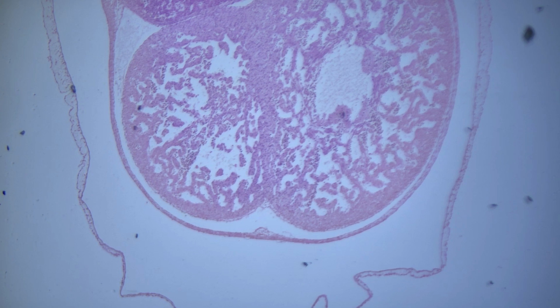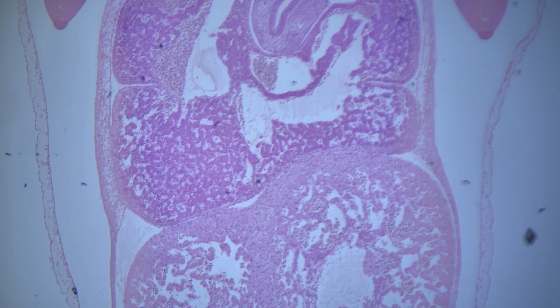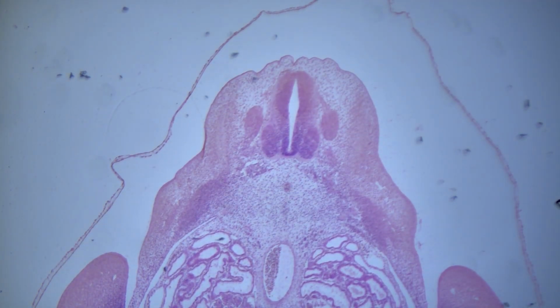This is a prepared slide of a pig embryo where we can see developing tissues and organs that originally came from precursor stem cells. Now, embryology is not the topic of this video, connective tissues are. This slide just gives us a clue as to how connective tissues are developmentally related, and that has to do with the mesenchyme.